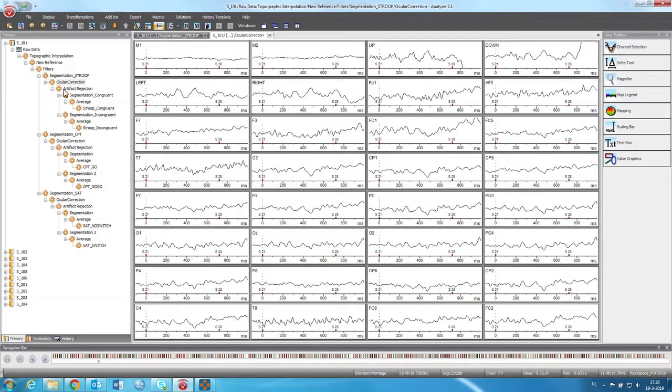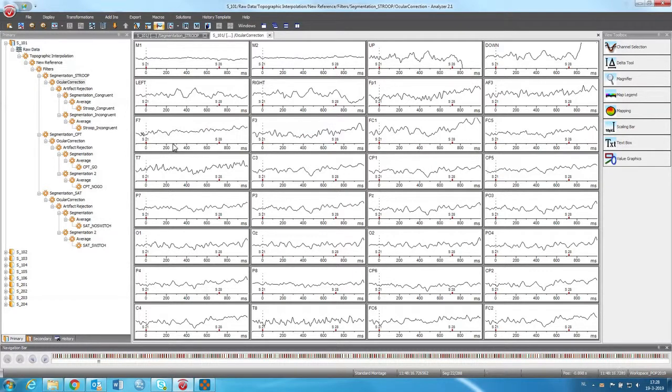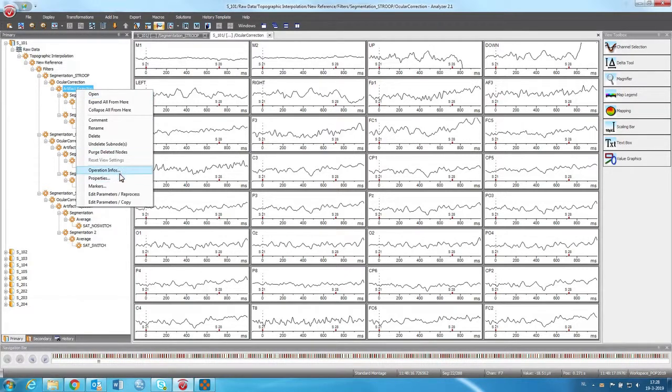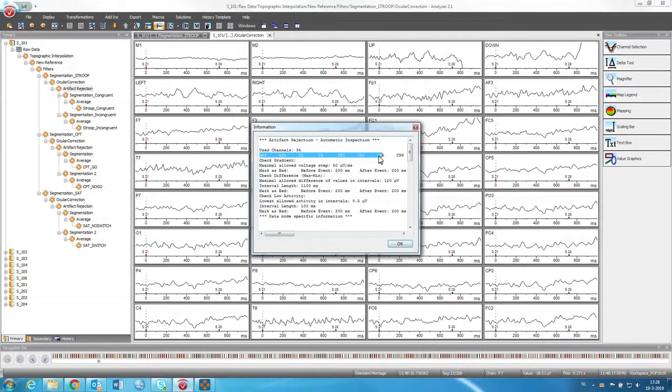So with artifact rejection it kind of like controls. So it goes over all these events on all electrodes. And according to some rules, it rejects trials. So the whole trial gets rejected.